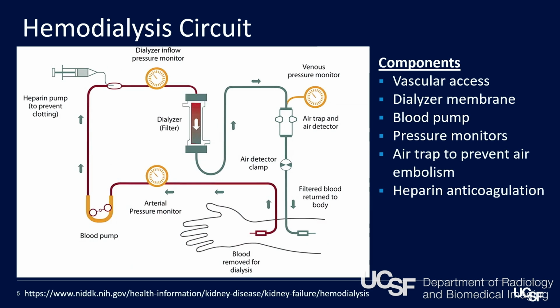Okay, so this is a dialysis circuit for a non-nephrology crowd, very simple. You have your access in the lower right, and this is all driven by a blood pump. Okay, the peristaltic pump is in the lower left, and that generates a negative pressure on this side. And the post pump, it generates a positive pressure. So the negative pressure pulls the blood out of the access, and the positive pressure pushes the blood through the circuit. It's kind of like squeezing toothpaste from the bottom of the tube.